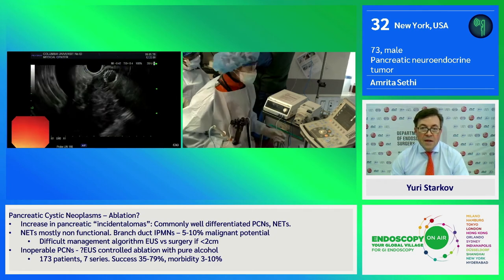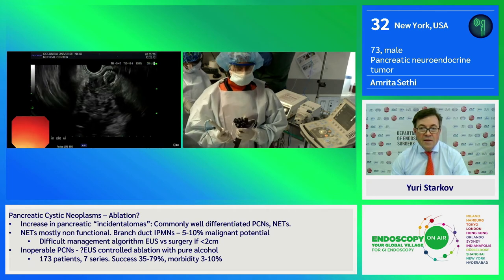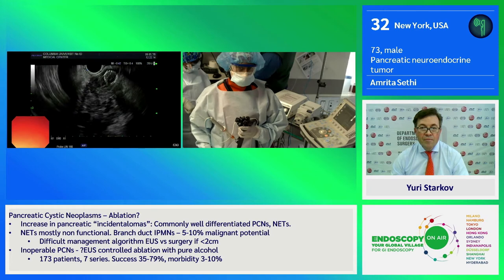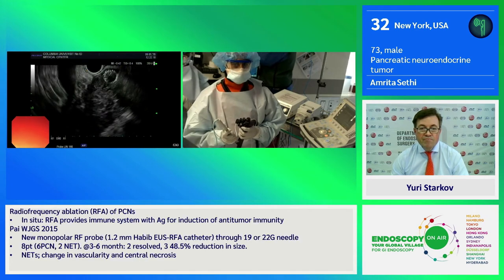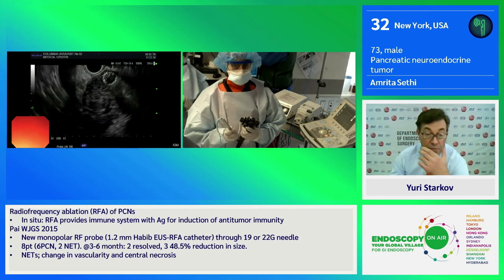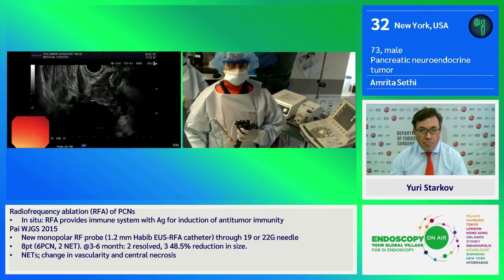We also have an impedance monitor. We are trying to achieve an impedance of 800 ohms. If we do not reach this, it might suggest that there is a degree of heat sink. So now I am going to try to enter the lesion with the probe itself.